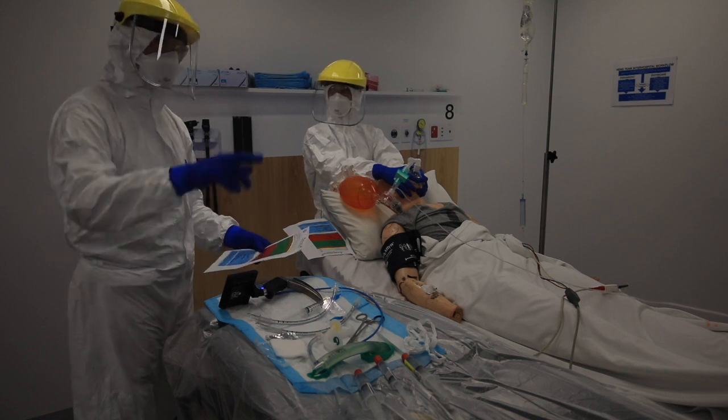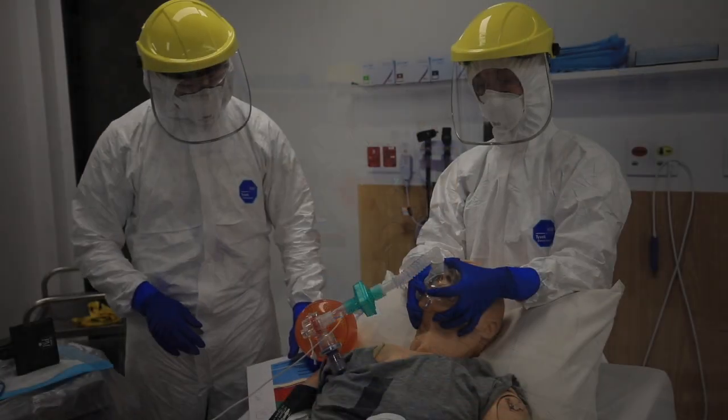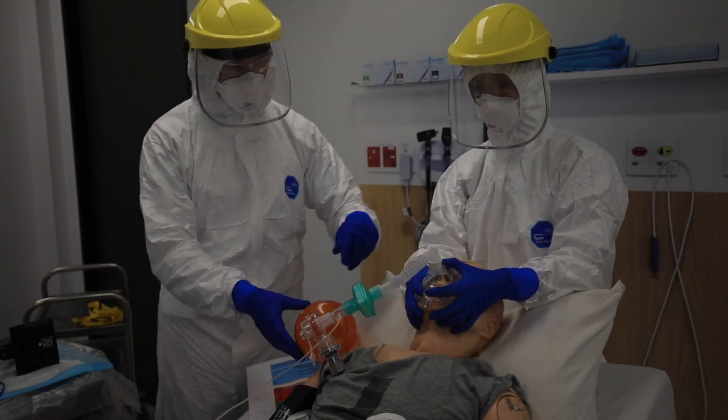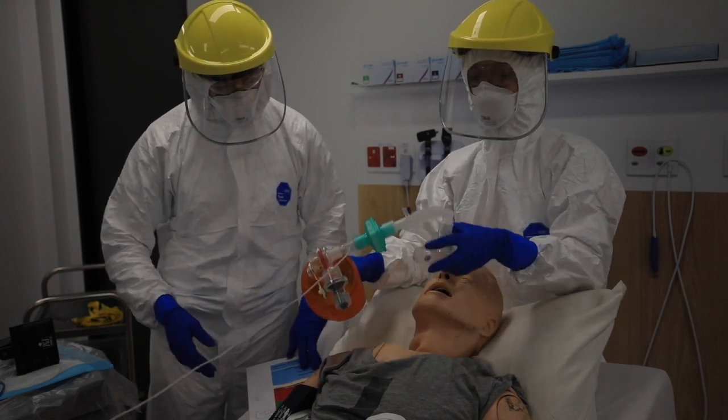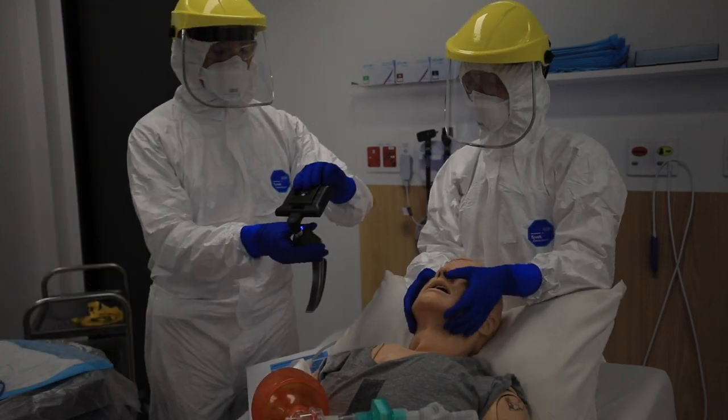Confirmed paralysis, Claire — jaw is loose, no end-tidal. Check. BVM away, facing away from the team — placing it over here. BVM is down and away.